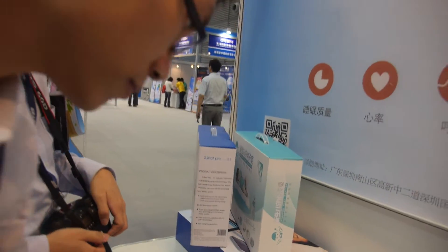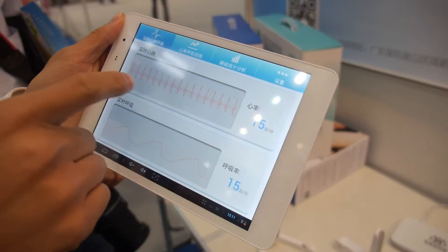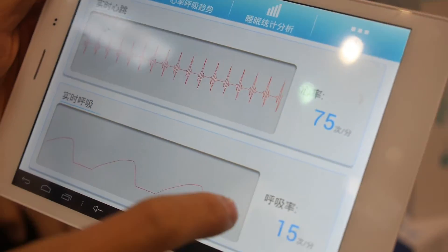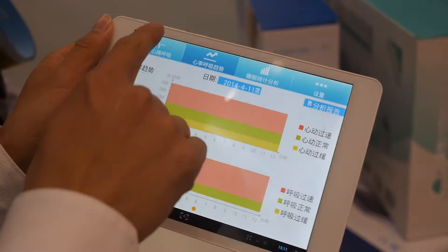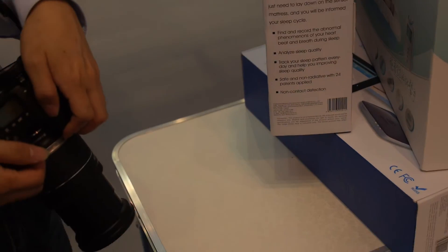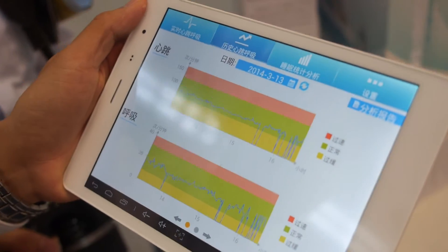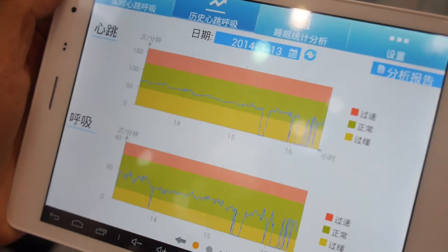Here in the application you can see the real-time heart rate and real-time breathing. This is an Android tablet. At this moment we only support the Android version.